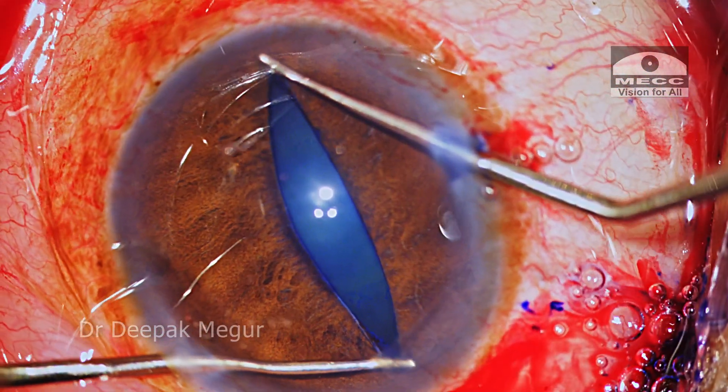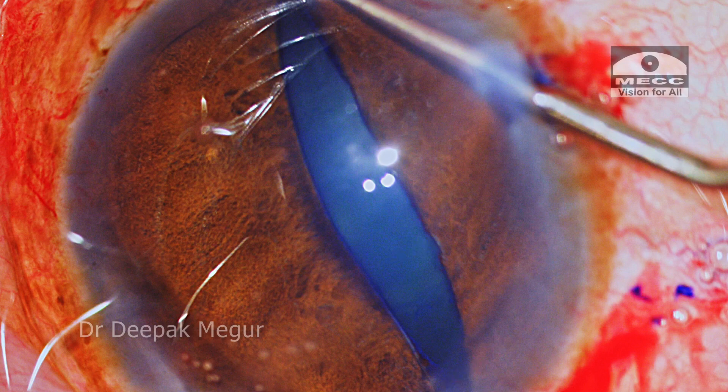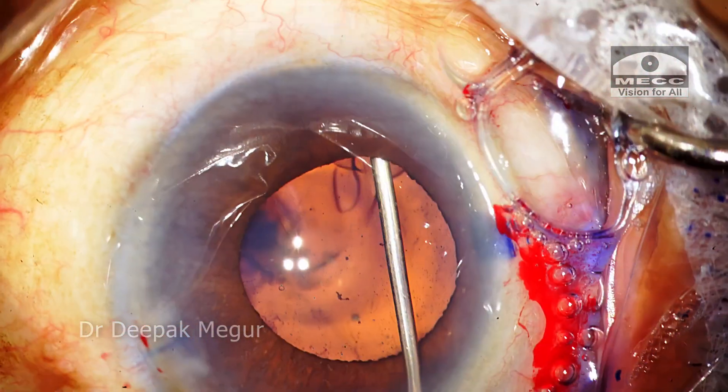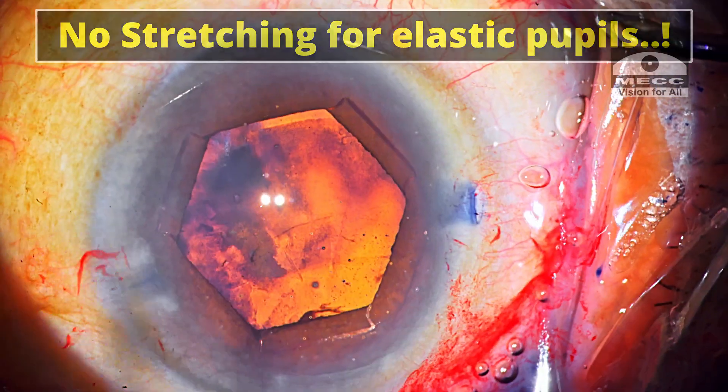Hence the amount of stretching we perform has to be judicious and need-based. In cases of a very rigid pupil, we may prefer to stretch the pupil a little more to achieve micro-sphincterotomies, which will help in better pupil expansion — but in most cases it is not necessary. Of course, stretching is not to be done in the case of an elastic small pupil. Thank you.